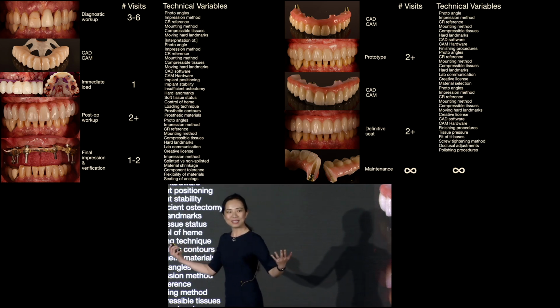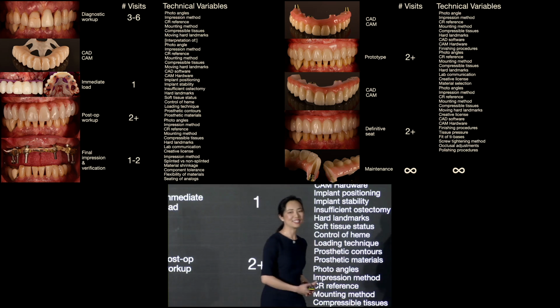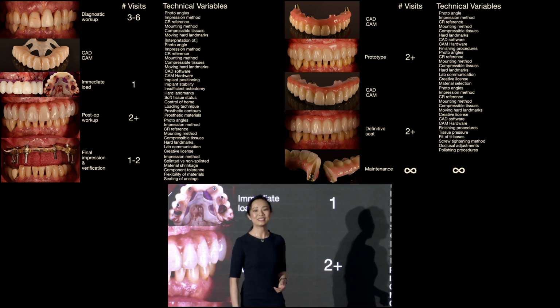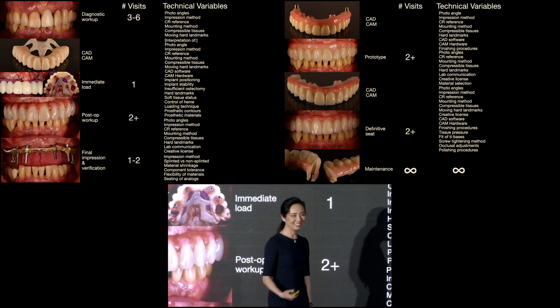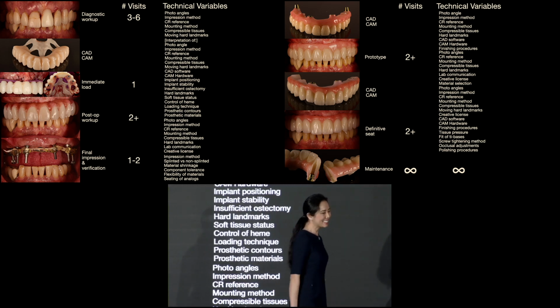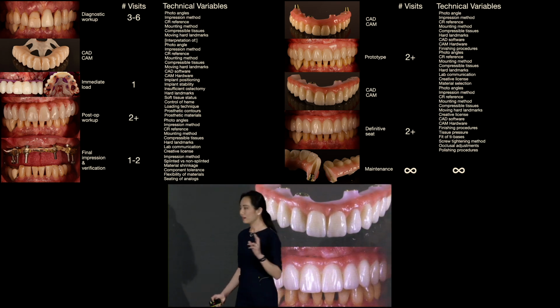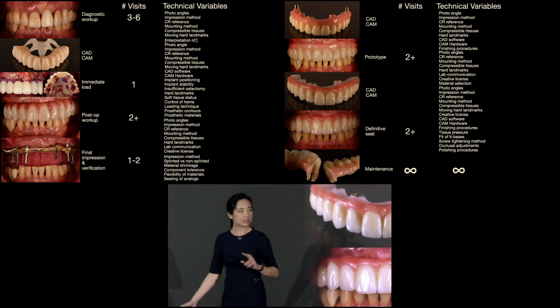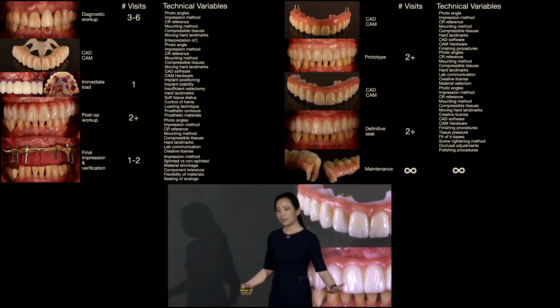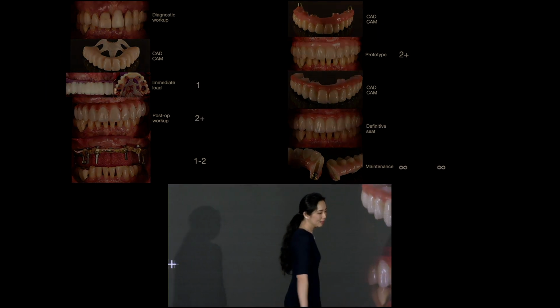How many people in this room have ever had to argue with their lab over their outcome? How many times have you sent a denture setup back to move the midline a millimeter? How long does it take the technician to move that midline by a millimeter? That is another great question, and maybe that's why we get the blowback. Just by looking at this huge list of different things, whether it's a technical issue on the clinical side or how we even take our photographs, our communication clearly cannot be that straightforward.